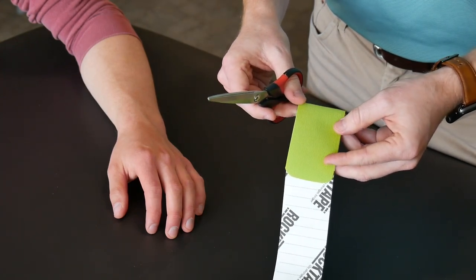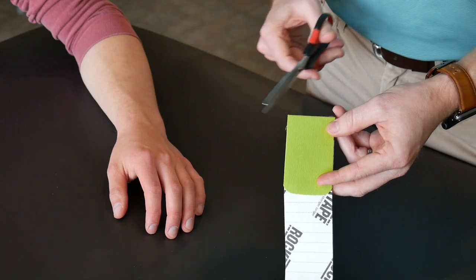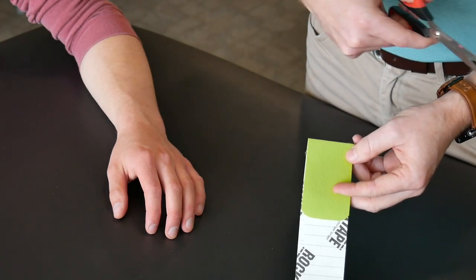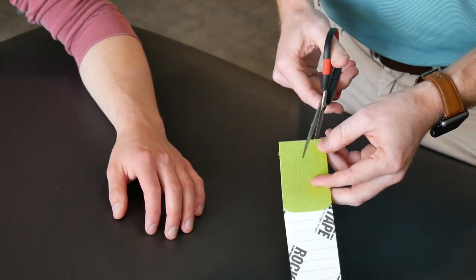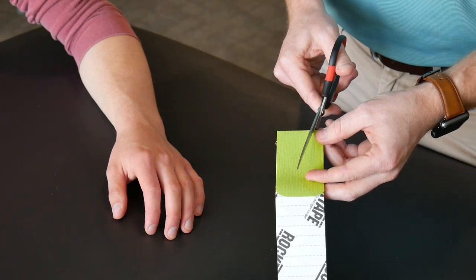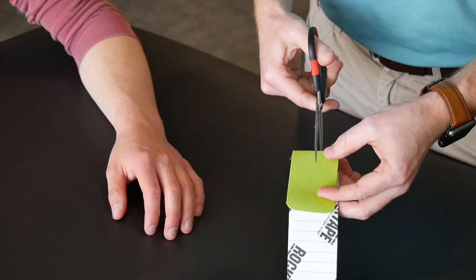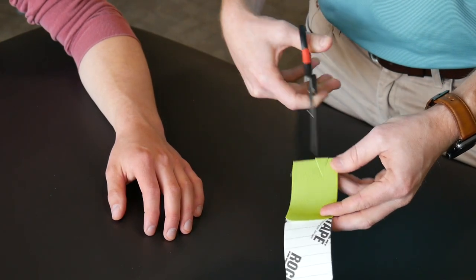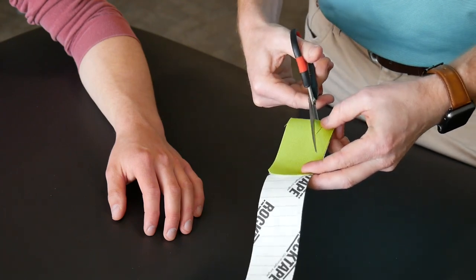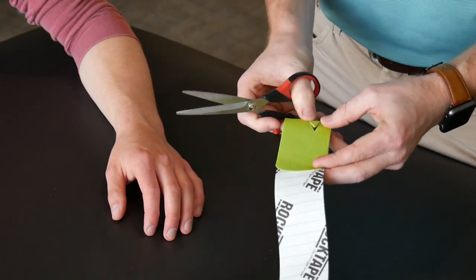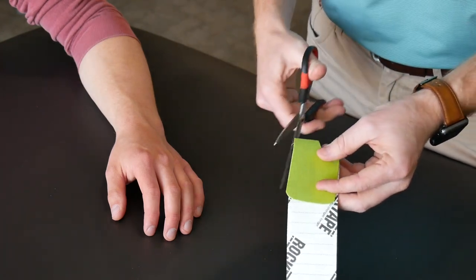For Dylan, his hands obviously a little bigger than that. So we're going to cut two on this one and then two on another piece of tape. So we'll go ahead and cut our triangles. After we get our triangles cut, we're going to thread his fingers through these holes once we open the tape up.